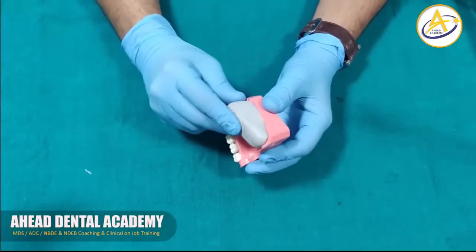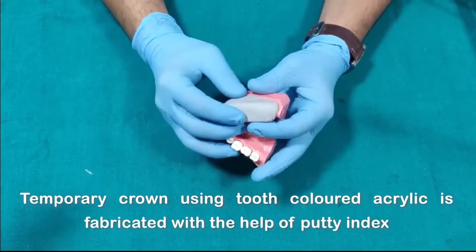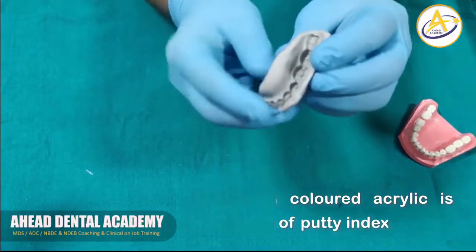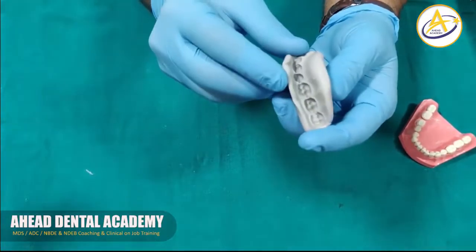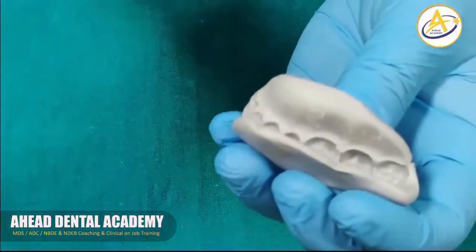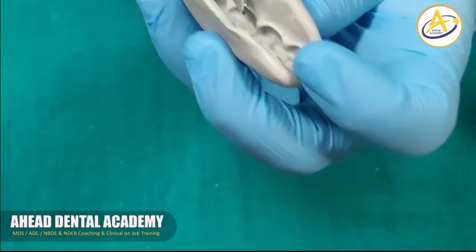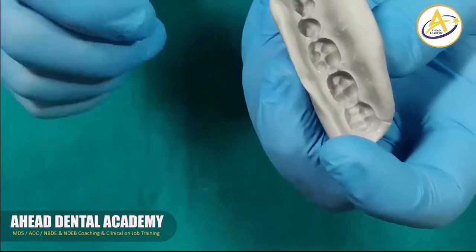While this putty index sets, we can see that it has become hardened, and then we remove the putty index. Now this is what we have been able to achieve using the putty index. Make sure that when you are taking a putty index, for the tooth that you need to temporize, at least one tooth adjacent on both the sides should be present on the index. This will help us in seating of the index.